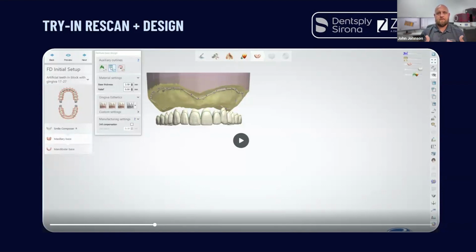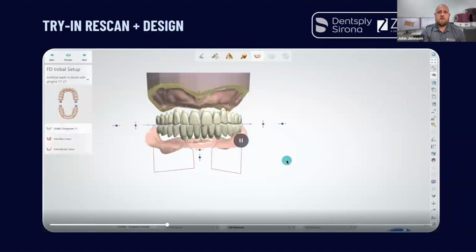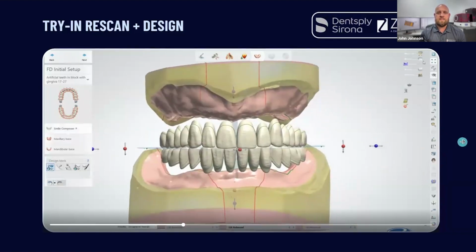So you have to go back through those redesign steps and make sure that your boundaries, or your anatomical landmarks, change a little bit. But what's great is that you've already had a try-in and now you've rescanned with the try-in. So I'm not scanning a new bite with the wax rim. I'm rescanning the actual physical denture that was there at the try-in. So that try-in comes in and it gives me all of the information that I had before.